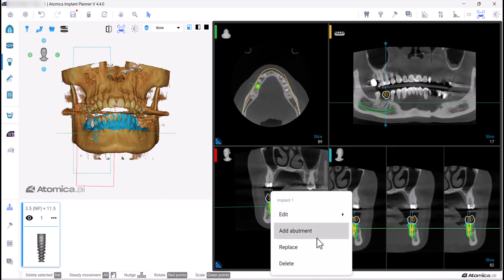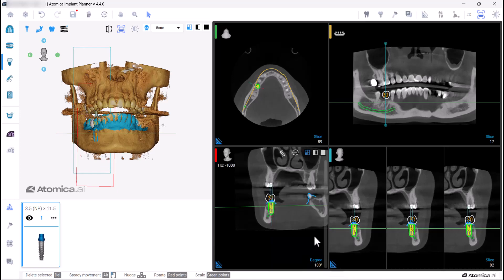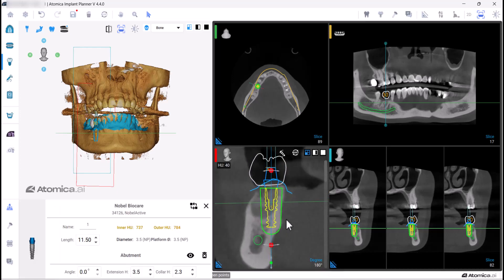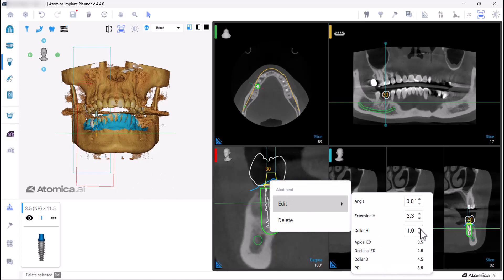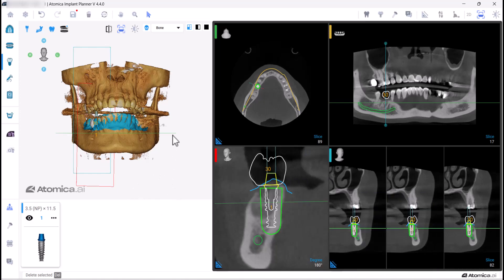The same applies for adding abutments — you can also edit its dimensions easily with the same steps as editing an implant. Now let's have a look at the other features included in the implant planning tab. You can measure the distance you want on any 2D view.